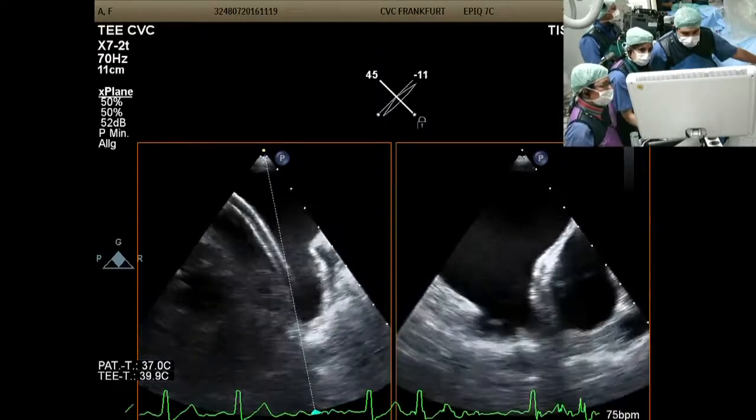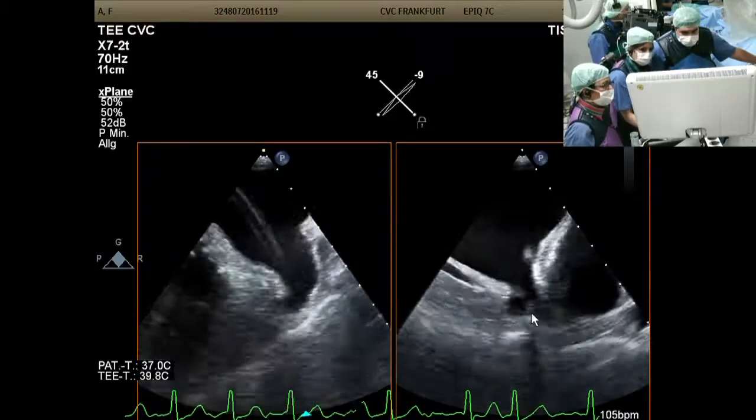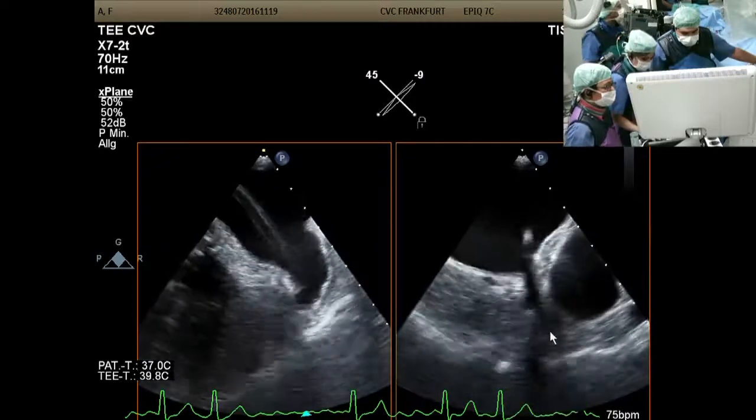If ever you wanted... Where is it on the 135? So you can see it just there. Yeah. And it's heading into... We lose it, actually. There's a shadowing. We can't quite see where it's placed. Yeah. And we can see the middle lobe and the posterior lobe nicely. Yeah. So it must be in the anterior lobe.